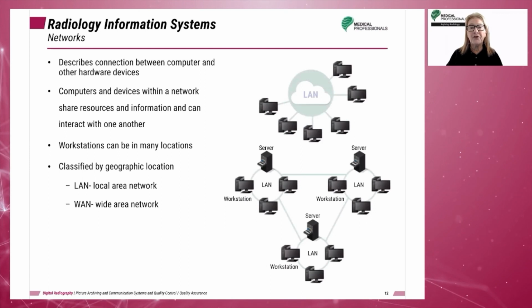In order to understand the interconnectivity and the basic communication systems used by HIS, RIS, and the Picture Archiving and Communication System, or PACS, it is necessary to have a basic understanding of networks and communication standards.